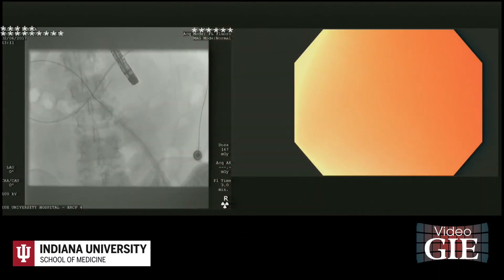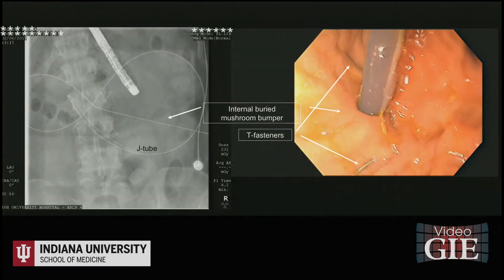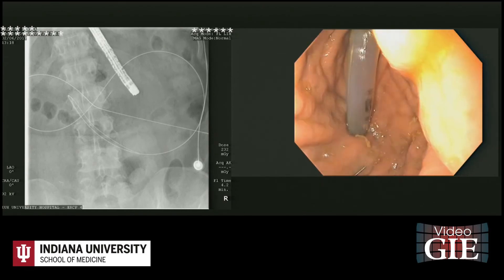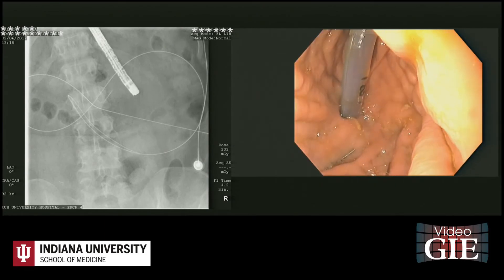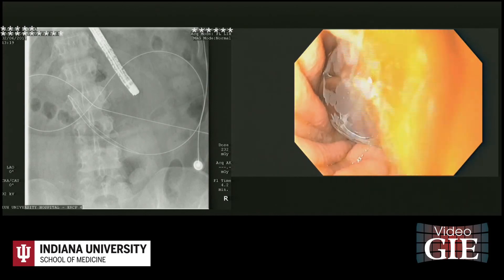A wire was then advanced through the existing J-tube. The J-tube, then the buried G-tube, were manually removed and replaced by a 28-French MIC balloon PEG-J, which was advanced over the guide wire. The internal balloon was overinflated to 12 cc of normal saline and snugged to the gastric wall by a standard external disc.